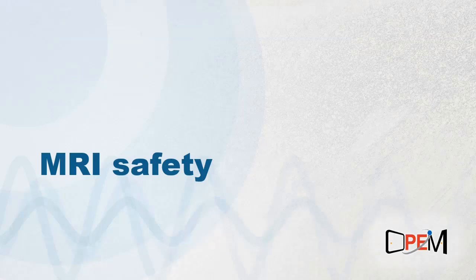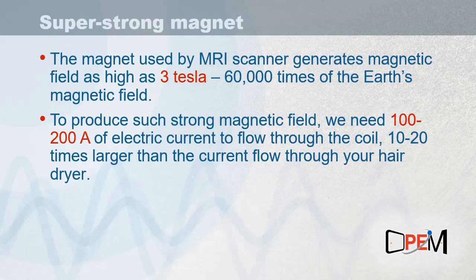Okay, MRI safety. MRI requires a super strong magnet. The magnet used by an MRI scanner generates a magnetic field as high as 3 Tesla, which is about 60,000 times Earth's magnetic field. To produce such a strong magnetic field, we need 100 to 200 amps of electric current to flow through the magnetic coil. That current is 10 to 20 times larger than the current that flows through your hair dryer.